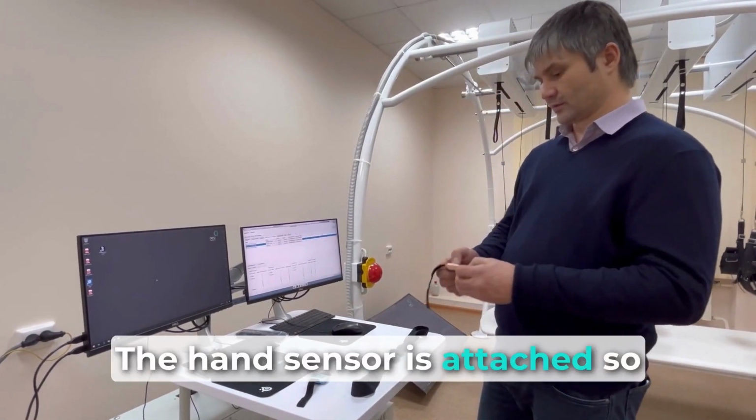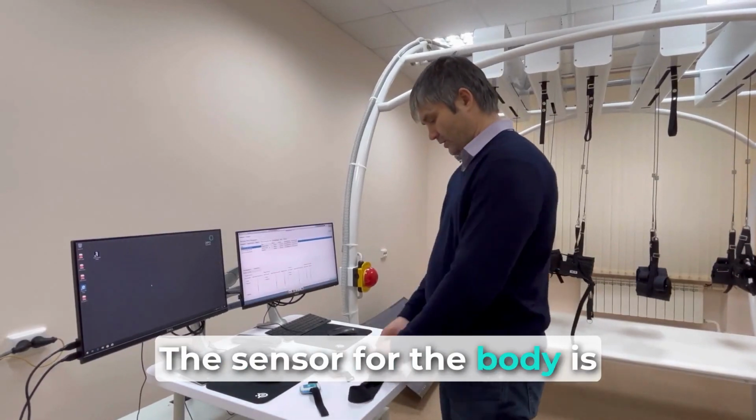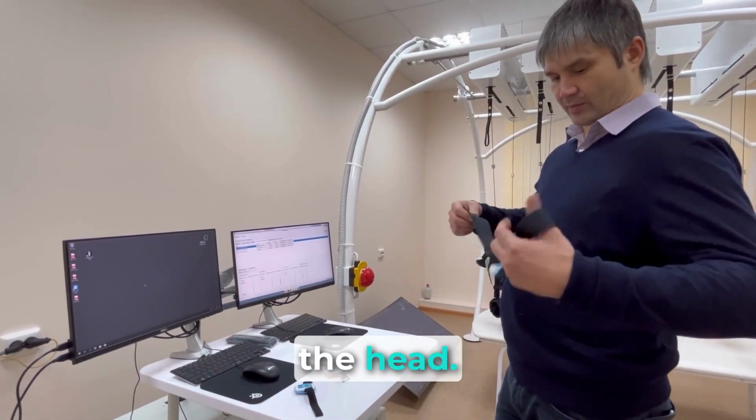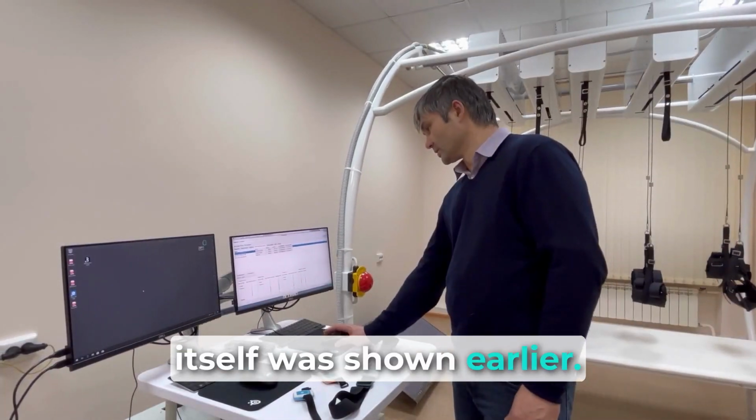The hand sensor is attached so that the LED is directed towards the hand. The sensor for the body is attached in such a way that the LED is directed towards the head. The principle of fastening itself was shown earlier.